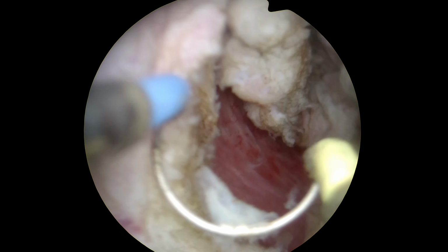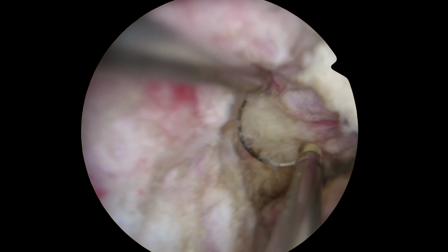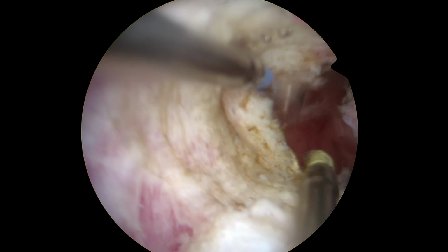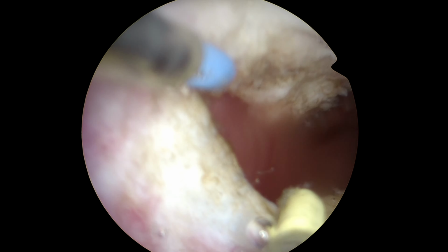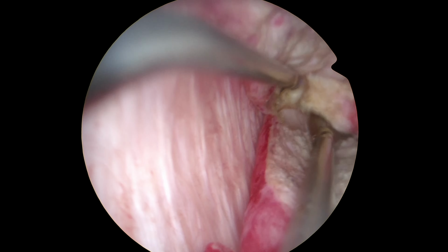So now the aim is to completely separate the right half. Okay, so I have done it.